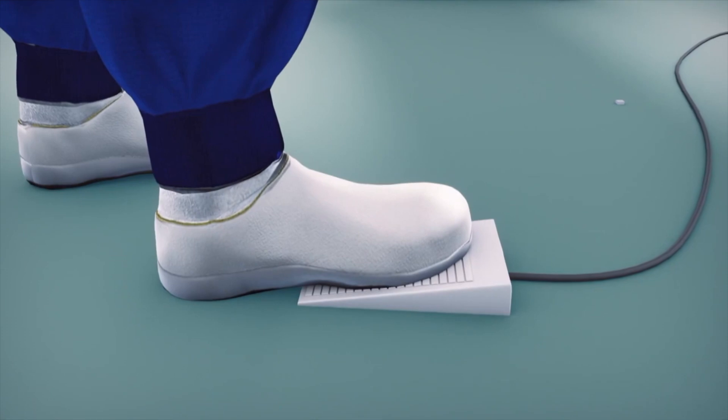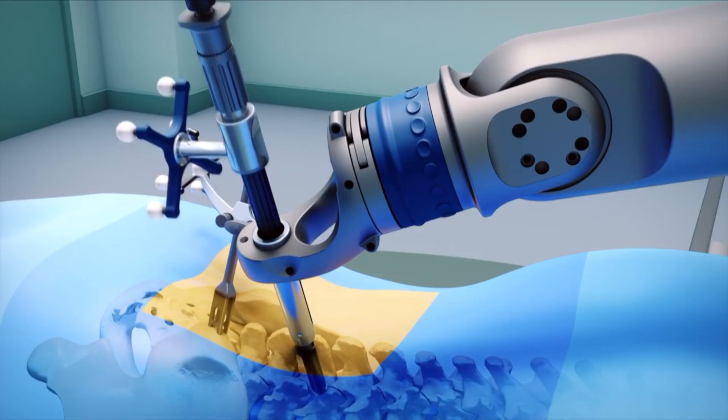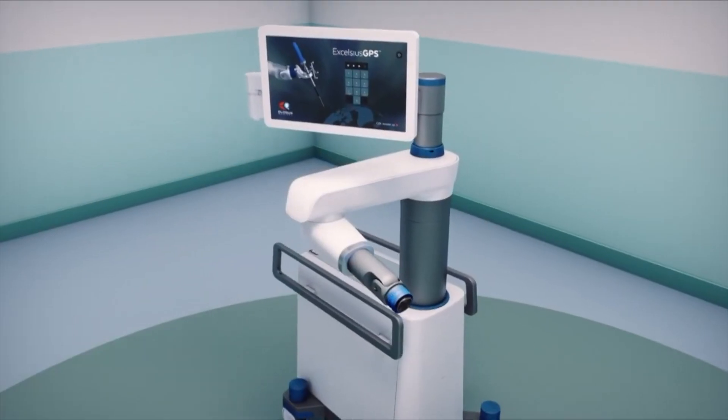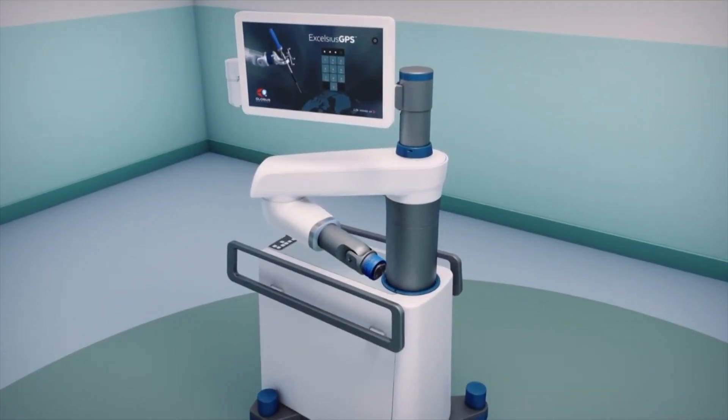The surgeon operates the robot for placement of the implants with utmost accuracy in the spine using real-time navigation.